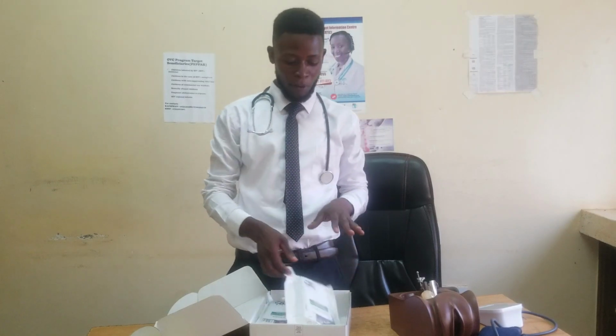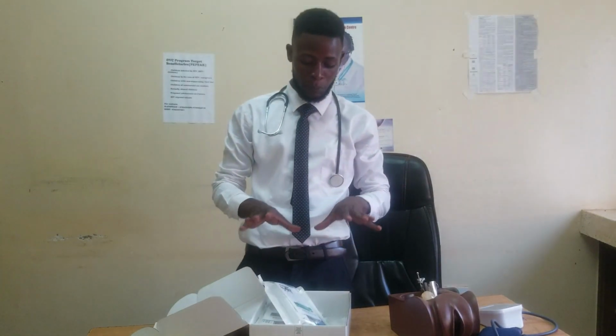Don't forget the sterile water to wet. Alright, so number 4, we are going to collect body fluid swabs. Someone can bite me, someone can pour saliva on me. During the fight, his or her blood can, in case I cause injury, drop on my body and stick there.